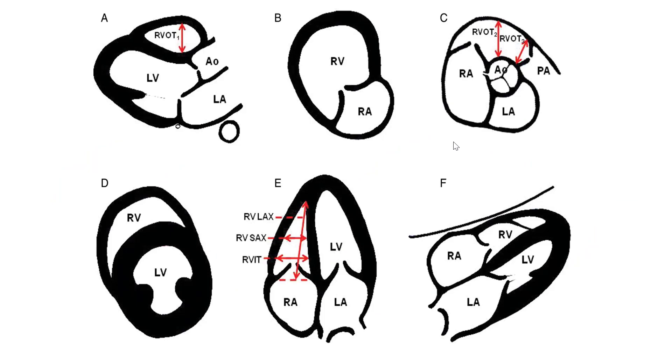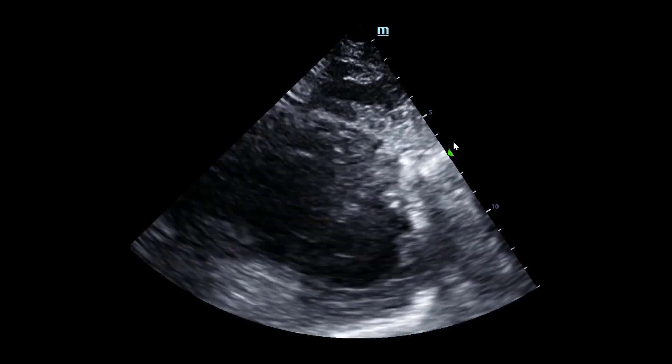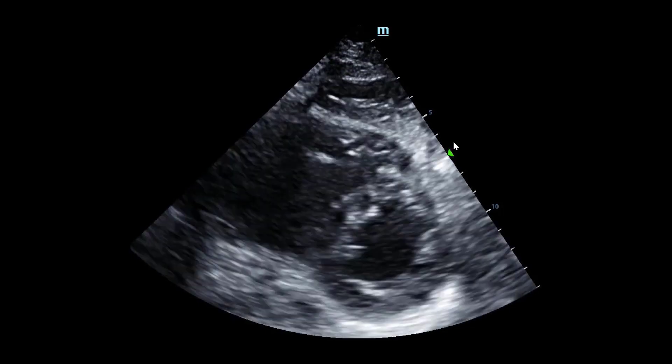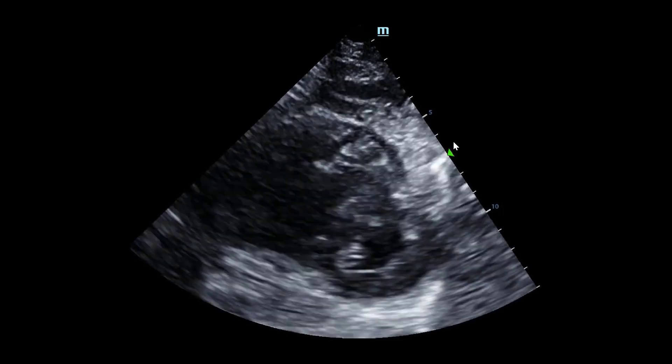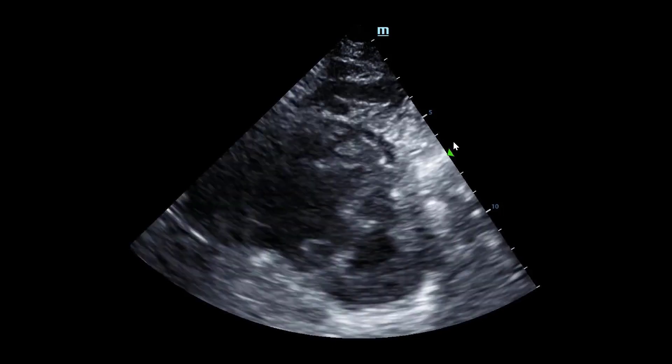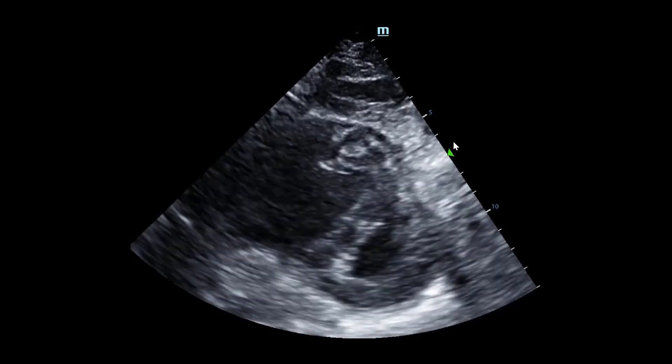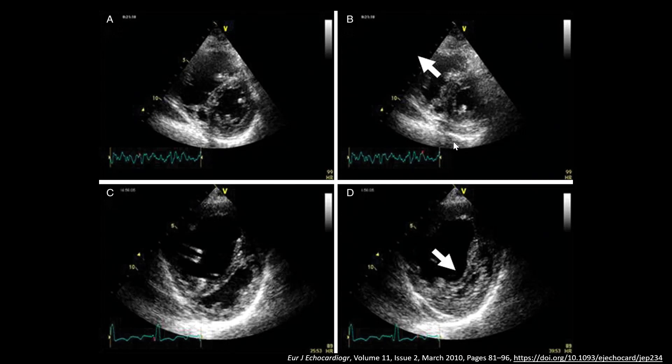Moving back to assessing the RV, we will discuss the parasternal short axis. This parasternal short axis view shows that the LV has a D-shaped configuration, likely as a result of pressure or volume overload from the right ventricle. Additional images demonstrate this same phenomenon — the LV appears in a D-shaped configuration and the septum is being compressed because of the large right ventricle.